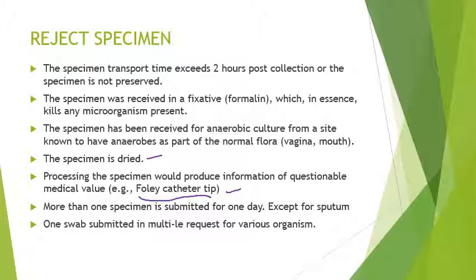So, if more than one specimen is submitted in 1 day, except for sputum or stool sample. So, please note, example, kapag urine sample, dapat isang specimen lang per day. One swab is submitted for multiple requests for various organisms. Okay, example, isang swab lang, rectal swab, gagamitin para sa anaerobic at aerobic. Hindi naman pwedeng ganun. Okay?